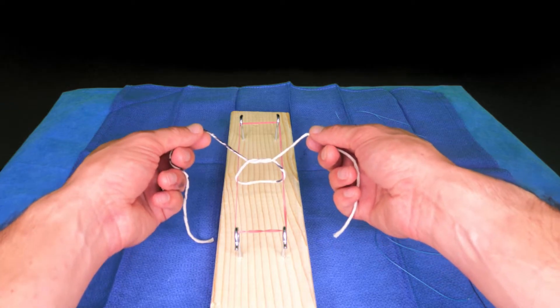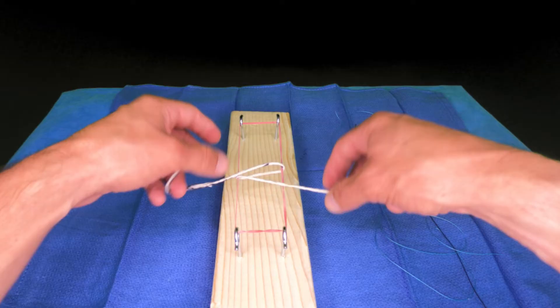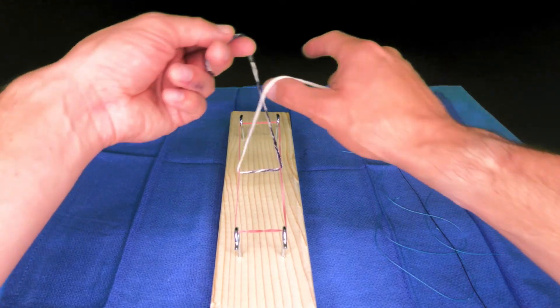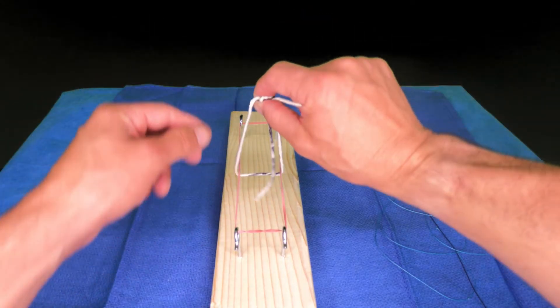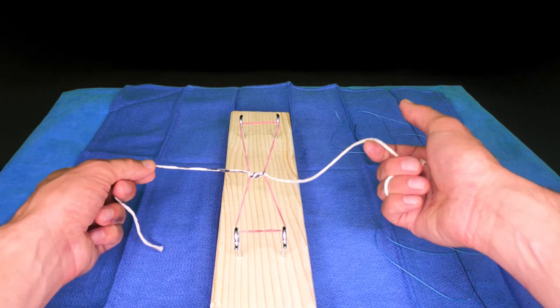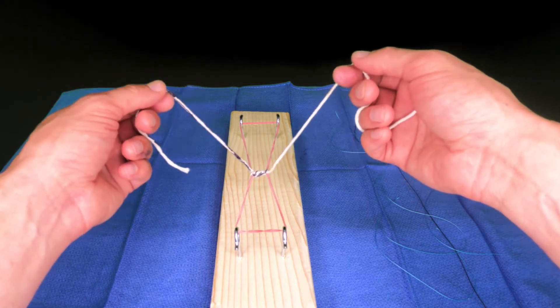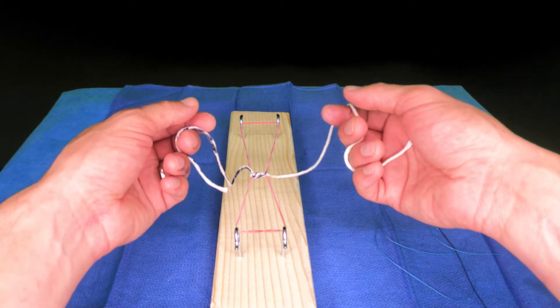So it could be a good idea to throw a surgeon's knot — you have a little tension there. In a surgeon's knot, we form the L and do two throws — do it again, finger through, L. Now that gives us two throws around, and we tie that down. That's going to keep its tension, as long as we don't pull up. If we pull up, it can lose the tension. So we always want to keep our hands soft.